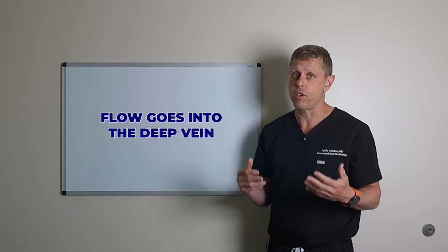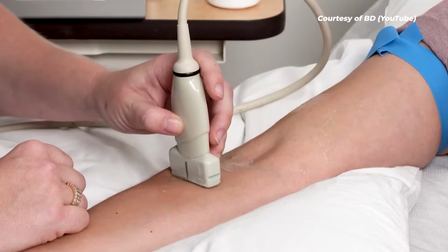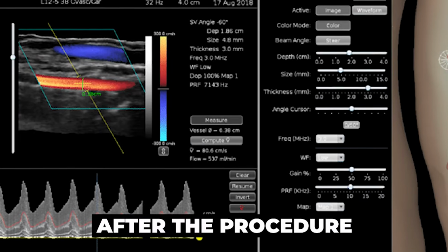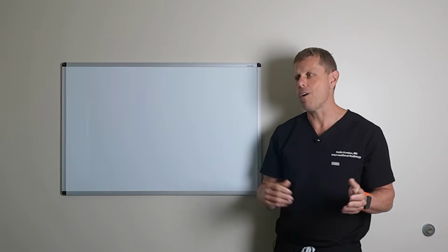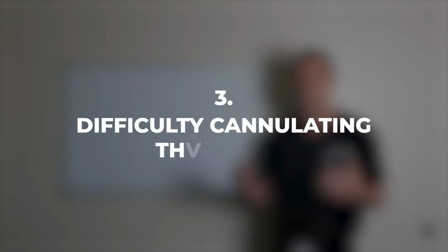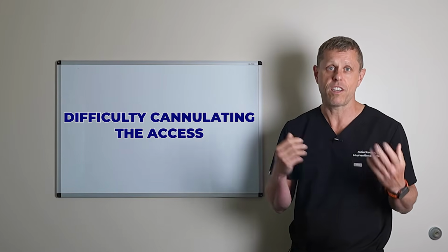We can measure the flow through the fistula or the graft with a simple ultrasound machine. And we usually do measure the flow before we do the procedure and after we do the procedure to make sure that we actually improve things. Now, the third problem that we're going to talk about is difficulty cannulating the access. Essentially, we're talking about an access that is hard to stick.